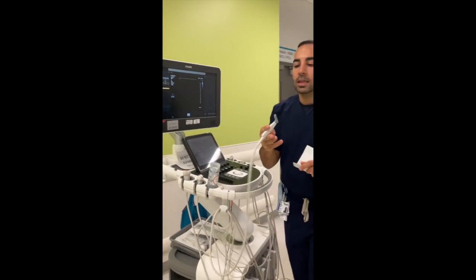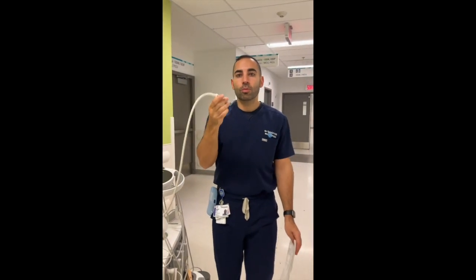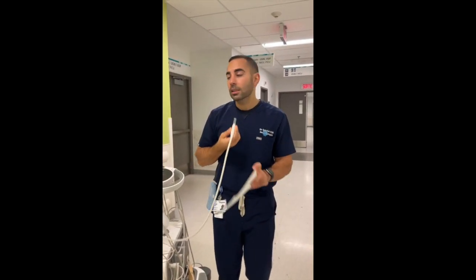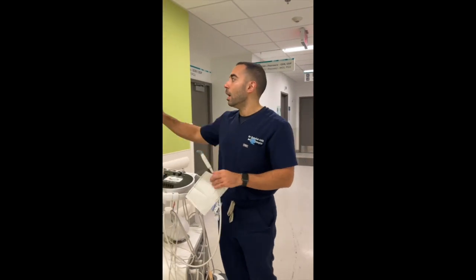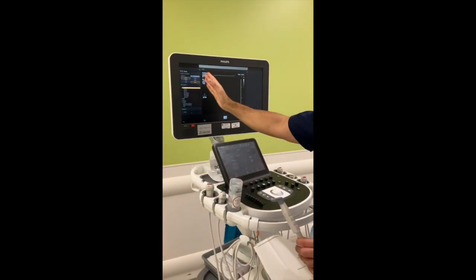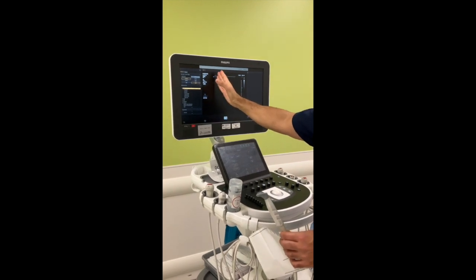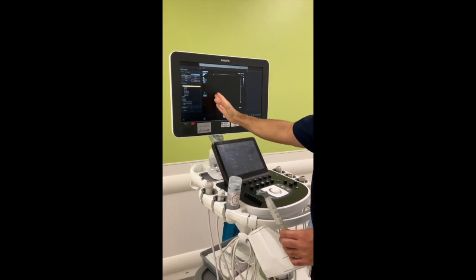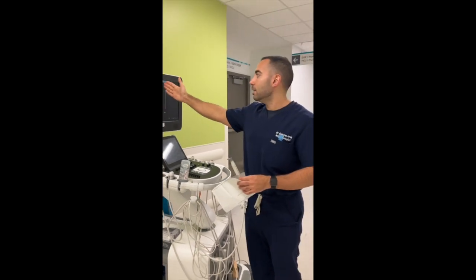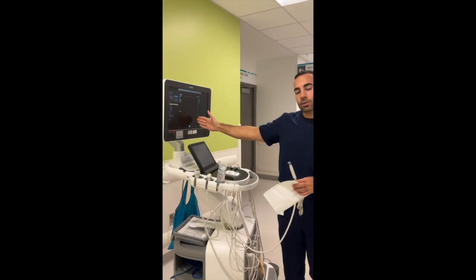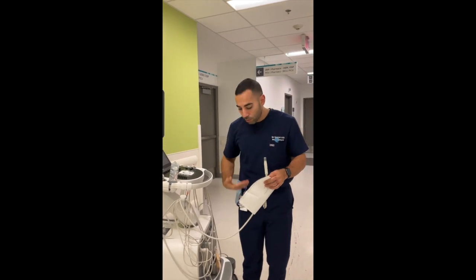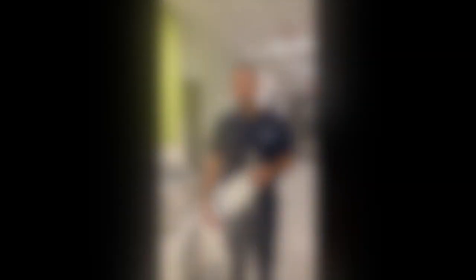Because the actual probe will be positioned longitudinally towards the head, the upper part represents the cranial portion of the images. Anything appearing on the left side of the screen will correspond to the cranial portions, and anything appearing on the right-hand side of the screen will be the caudal sections, or whatever is closer to the lower part of the body.